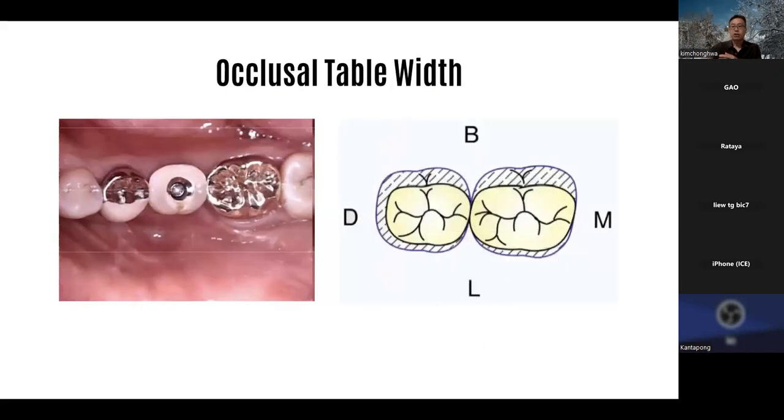That'll create some lateral forces. Second thing you can do is you can reduce the amount of unhealthy forces applied to the implant by reducing the occlusal table, which we have done long time ago. I guess a lot of us don't do this anymore because we've got wide diameter implants, and we are aware of the biomechanics of implants.